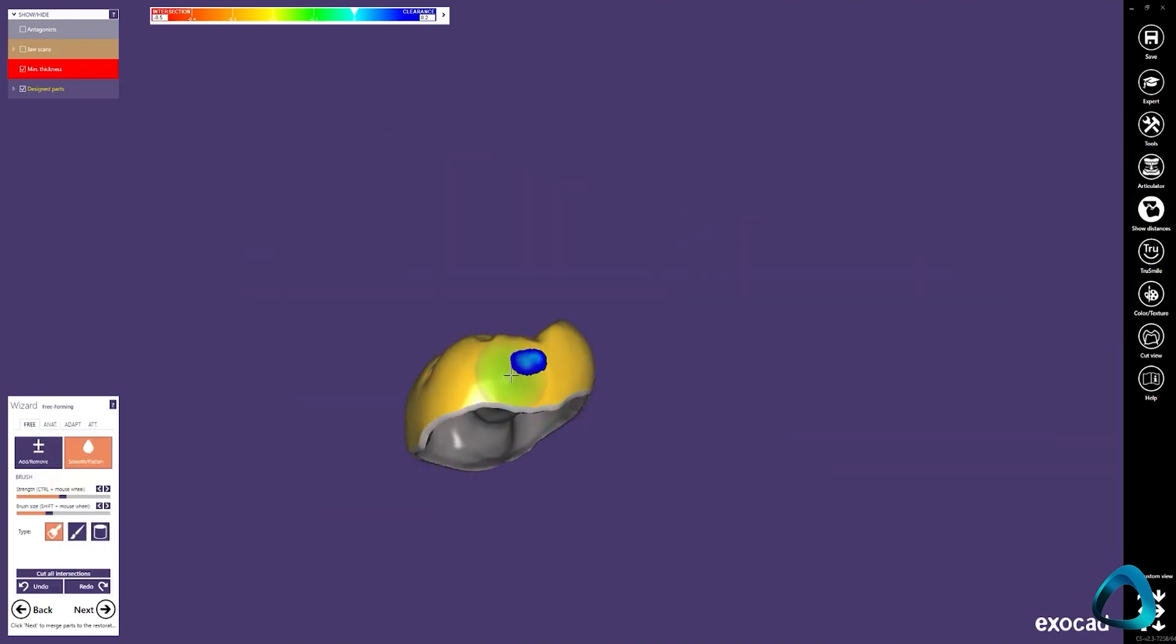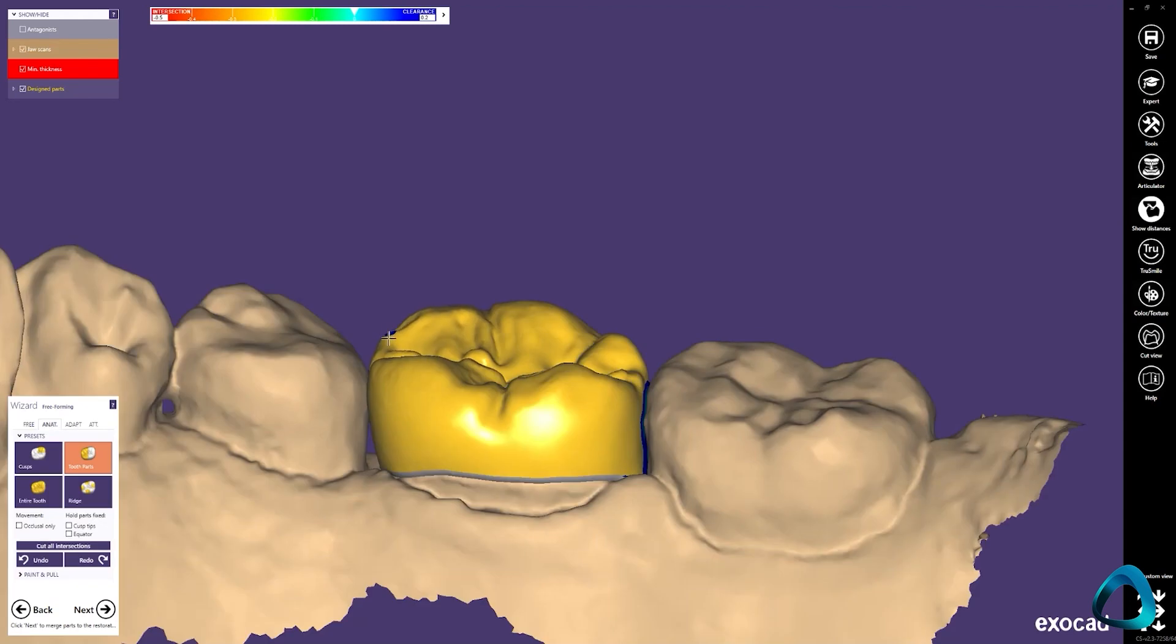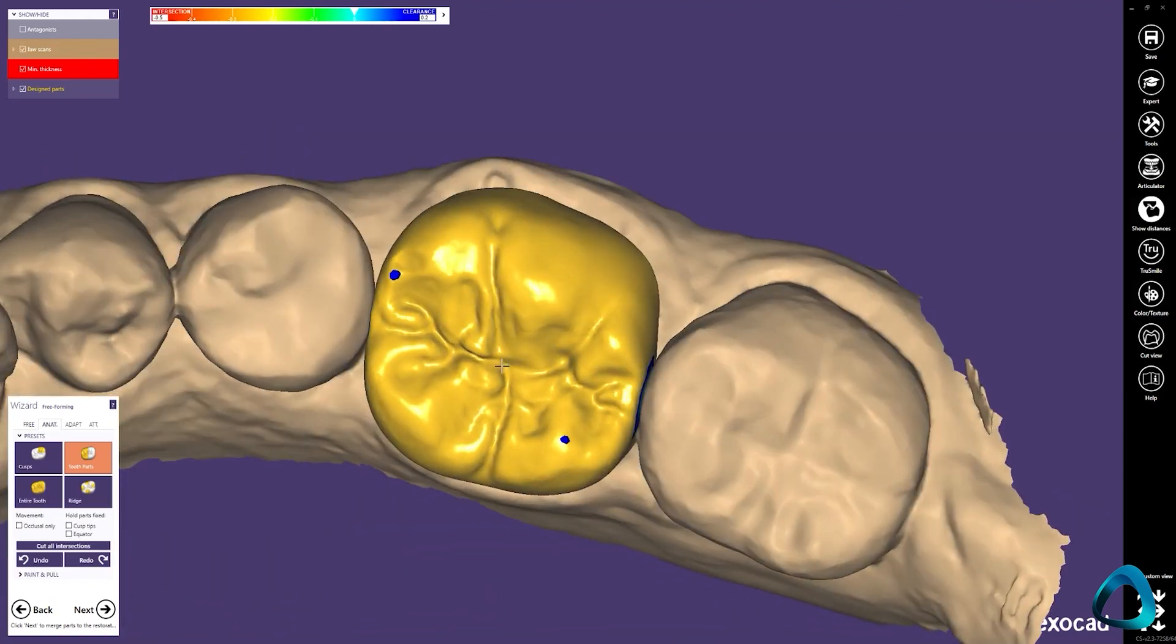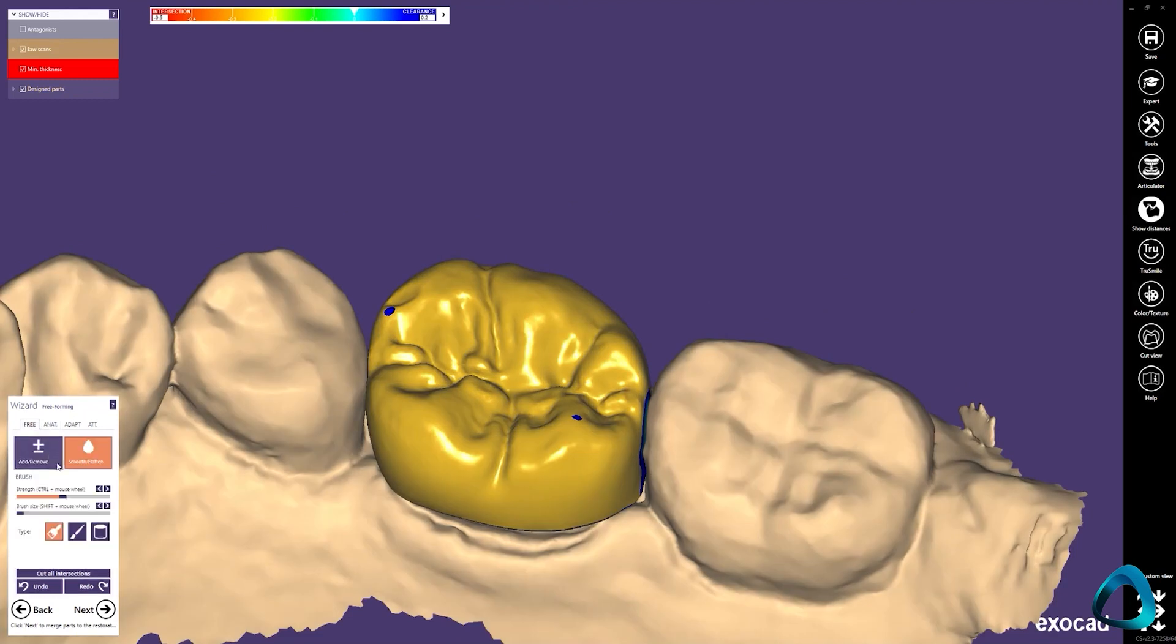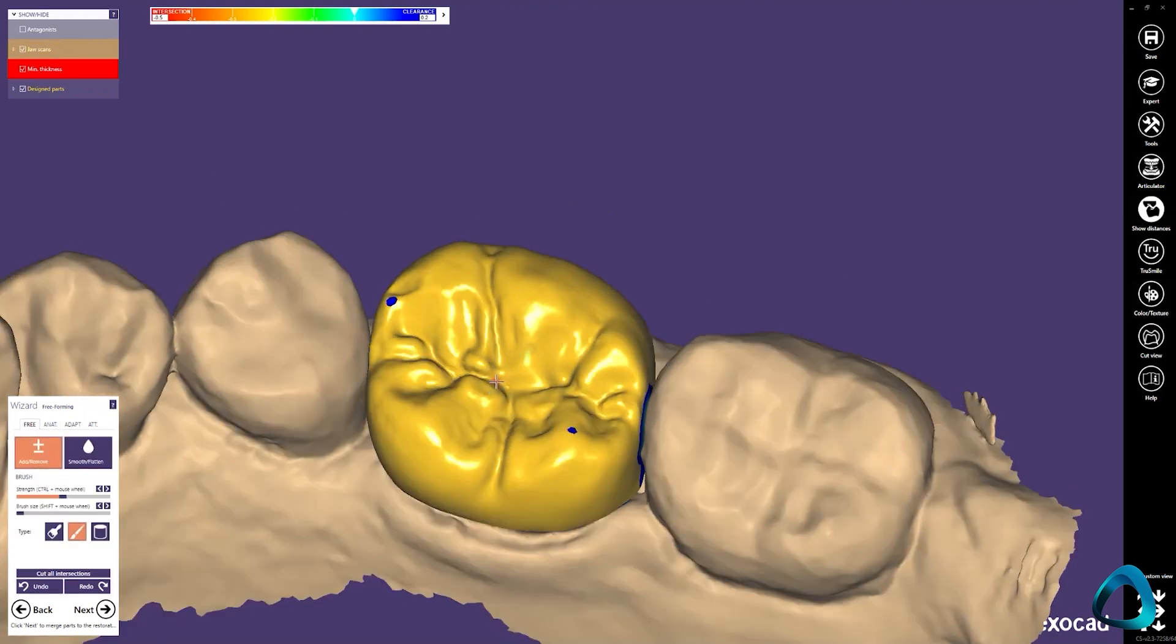Adjust the interproximal contacts. This is vital when designing restorations as you don't want a tight contact or even worse an open contact. You also need to make sure you check the occlusion and ensure the restoration fits seamlessly in the mouth so it doesn't require any high spots to be ground down.